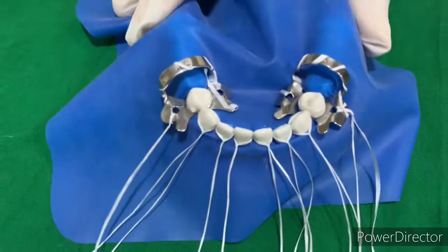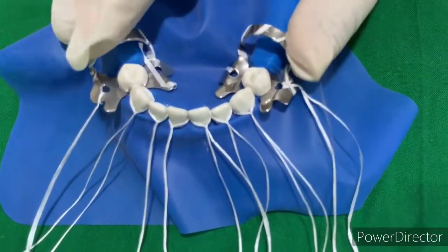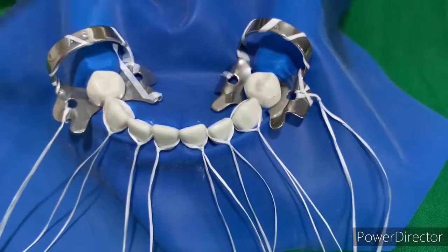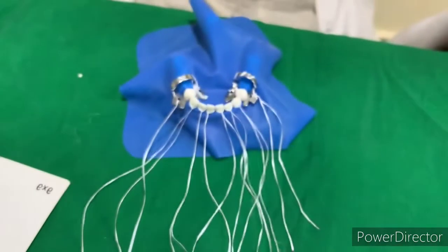This is how we made the floss tie. This is the anterior isolation of the teeth from canine to canine. Thank you.